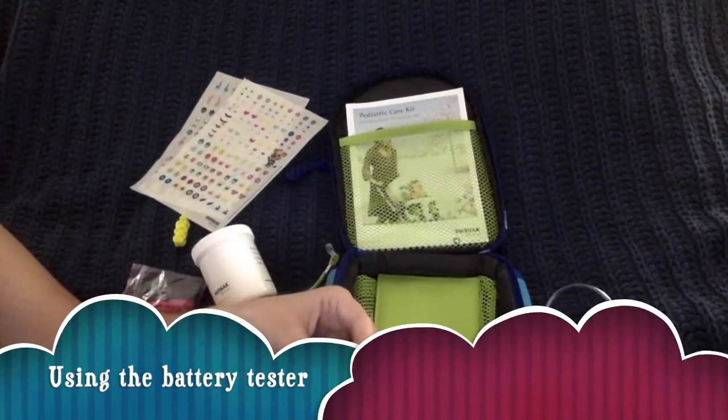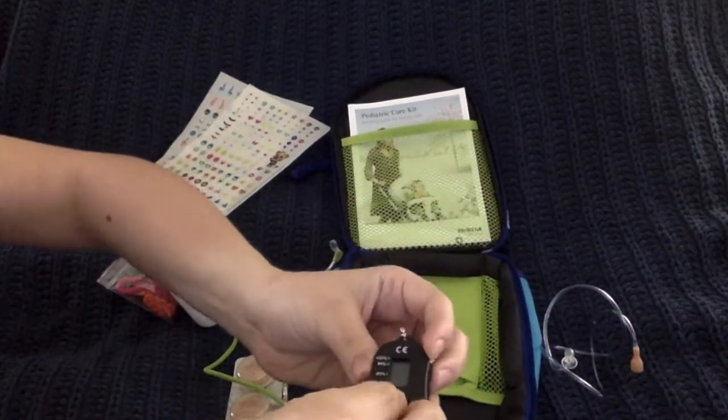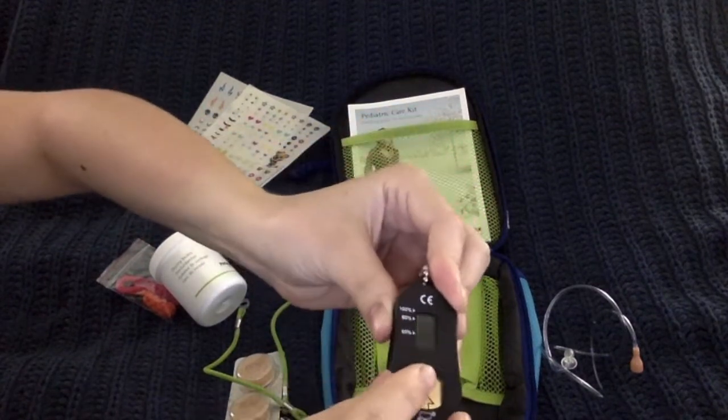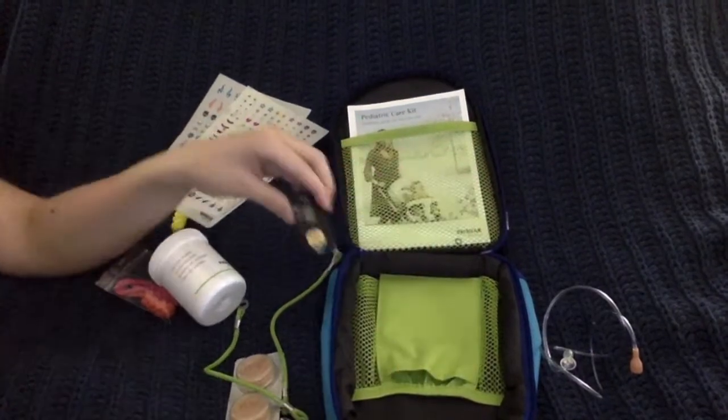Battery tester, and you place it smooth side up. So we have 2 sides, and we'll place this smoother side facing up onto this gold plate, and we just push it up against the bar, and it'll tell us if we have enough juice.